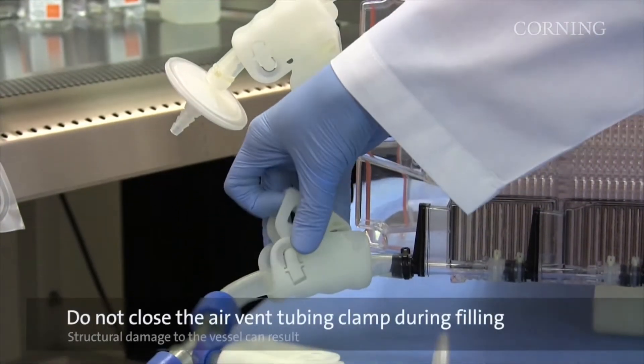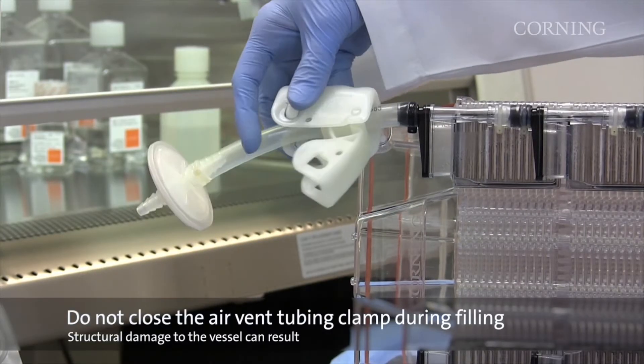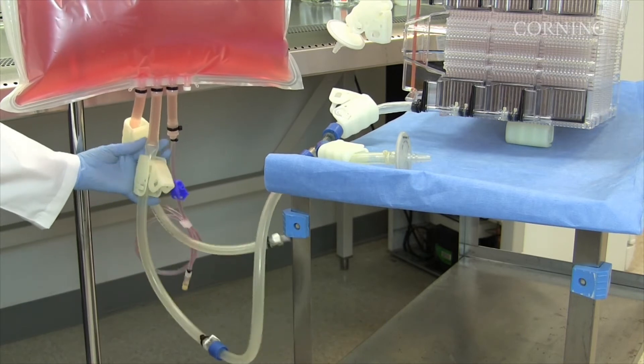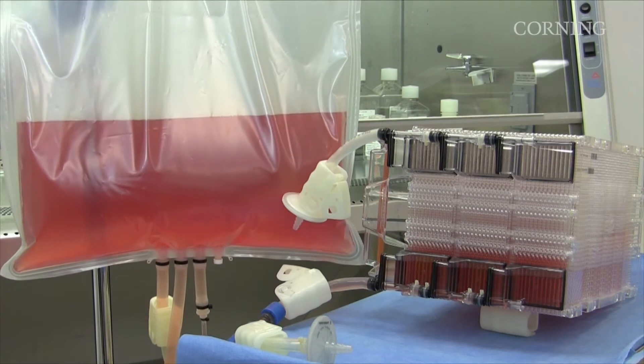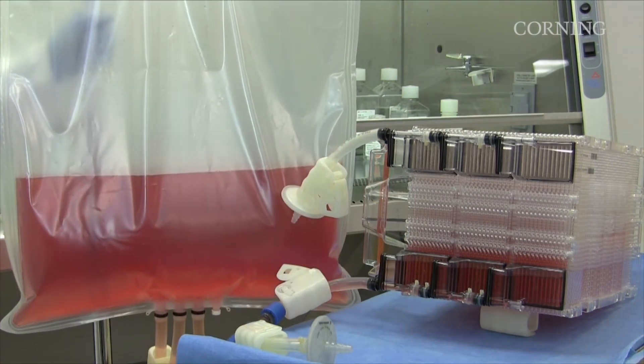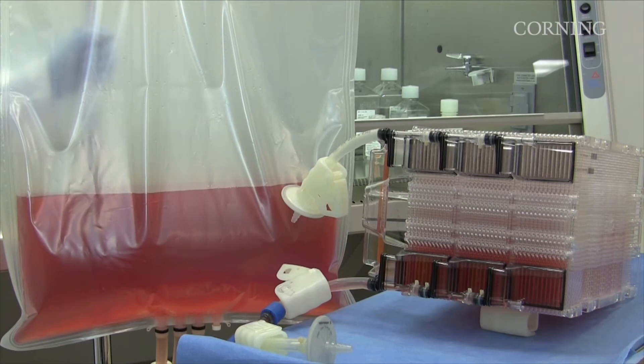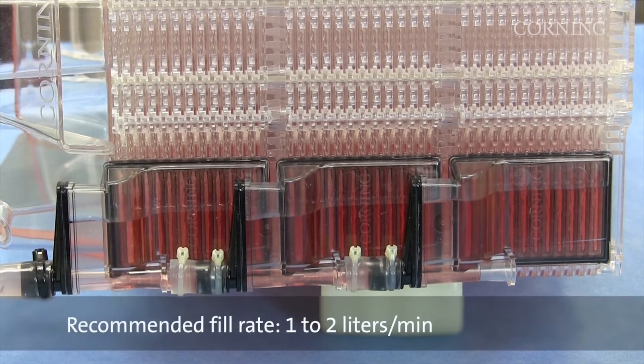To begin filling, open the liquid handling tubing clamp and air vent tubing clamp. Open the source vessel clamp to allow media to fill the HyperStack vessel. To control the fill rate, slowly raise or lower the height of the source vessel to increase or decrease flow into the HyperStack vessel. The recommended rate for pump or gravity filling is 1-2 liters per minute.